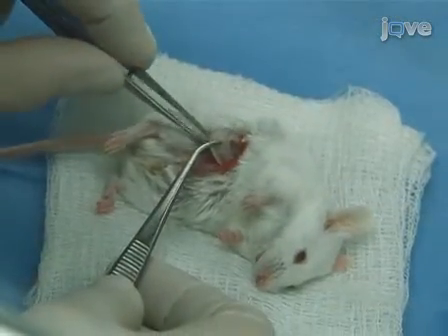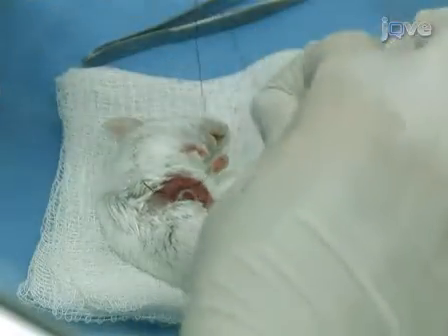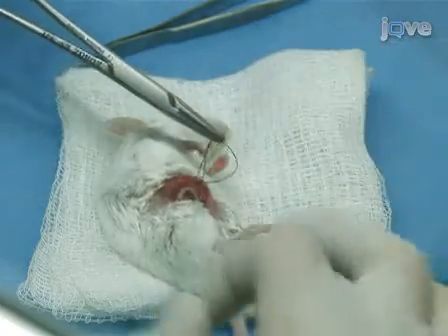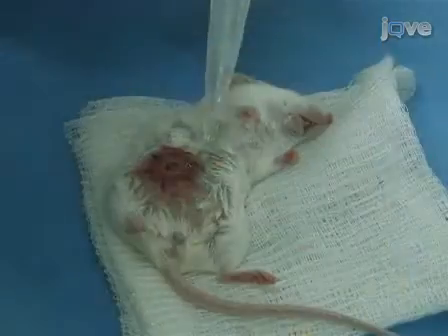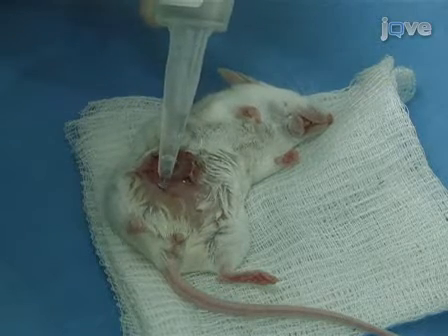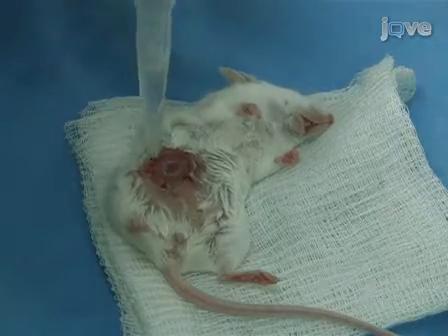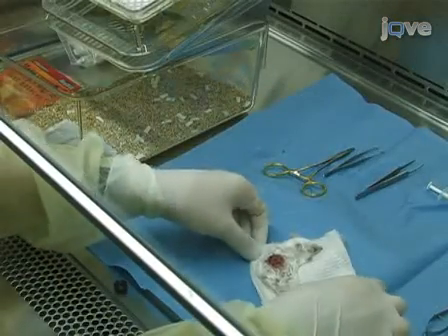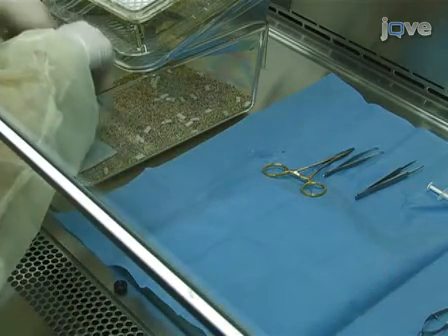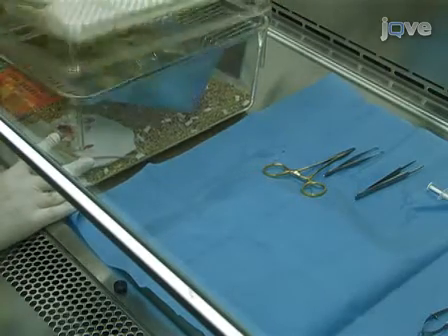Insert the MIW such that there is skin on top of the MIW base and suture it in place. Use tissue adhesive or cyanoacrylate to fill in the suturing holes and secure the MIW to the skin. The animal should now be left to recover for the next 3 to 4 days before the first imaging session takes place. In preparation for the imaging session, we can describe the imaging box.